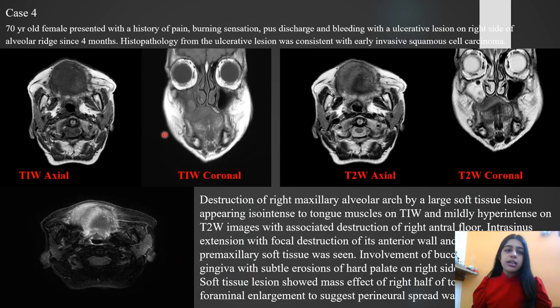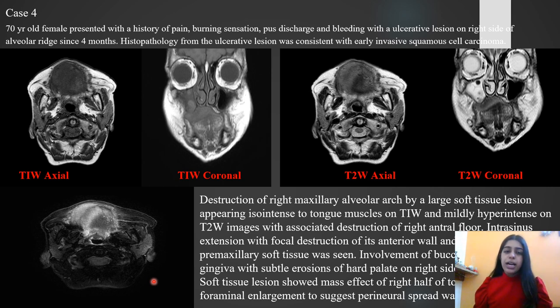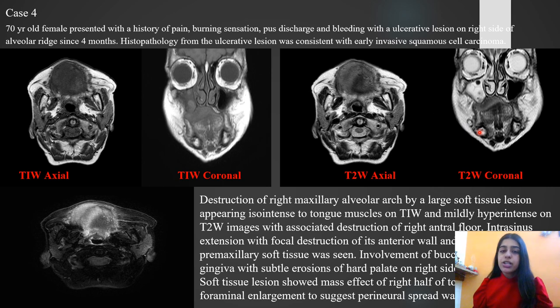In the next case, a female presented with a history of pain, burning sensation, discharge, and bleeding with an ulcerative lesion in the right side of the alveolar ridge for four months. On MRI, we can see destruction of the right maxillary alveolar arch by a large soft tissue lesion appearing isointense to tongue muscles on T1-weighted images and mildly hyperintense on T2-weighted images, with associated destruction of the right antral floor. Intra-sinus extension was also seen.